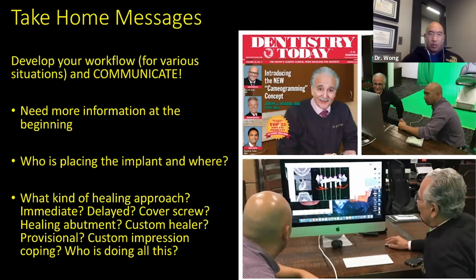This is really important because a lot of times, patients will come in with a hopeless tooth and somebody will just take the tooth out, right, without even thinking about what the next steps are. We need to talk about who's placing the implant and who is telling that person where to put the implant. We need to talk about the healing approach, whether we're doing it immediate or delayed, or is the surgeon putting a cover screw on or a healing abutment or a custom healing abutment? Are they going to eventually give you a provisional?